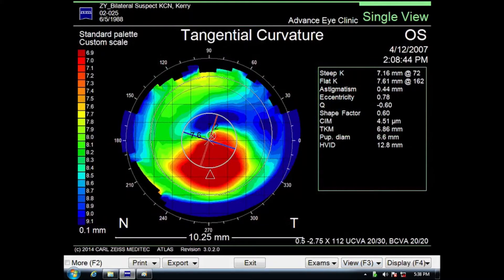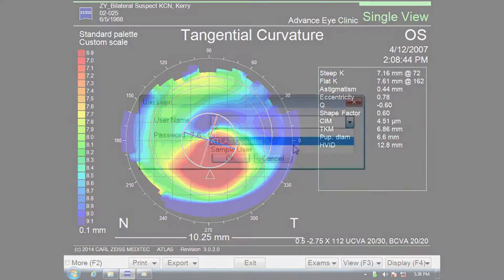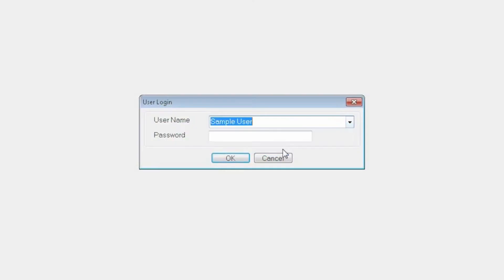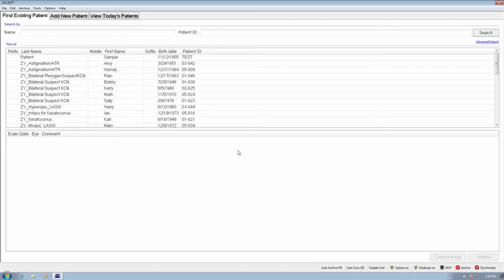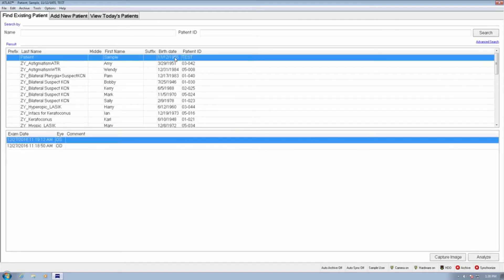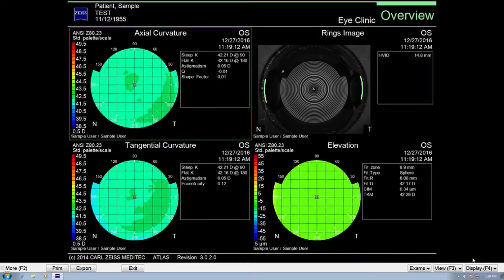To create a customized topography map, start by logging into the Atlas software. Find a test scan in your patient database. Opening a test scan will allow you to see the changes you are making and adjust the map to your desired report output.